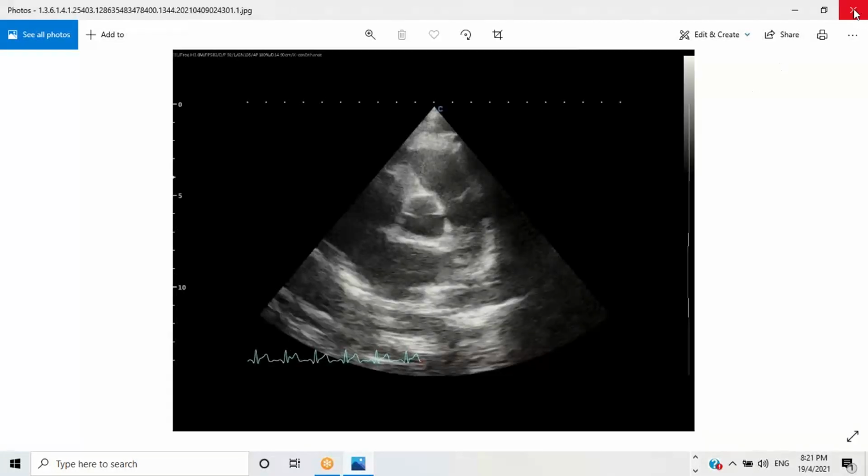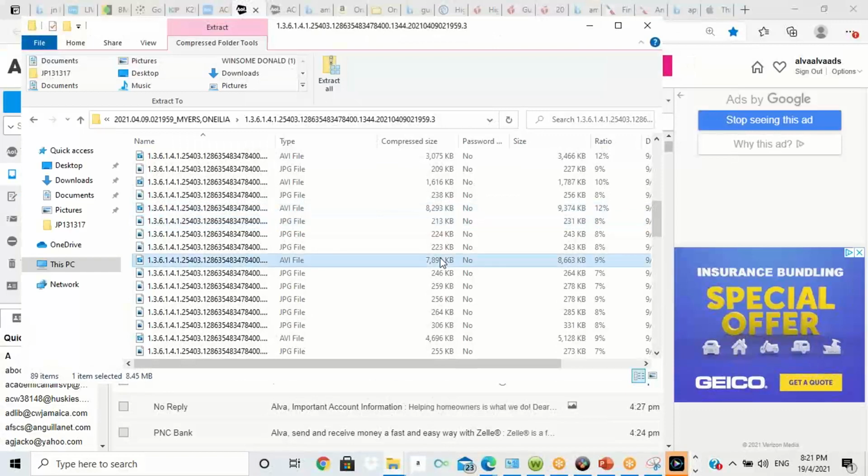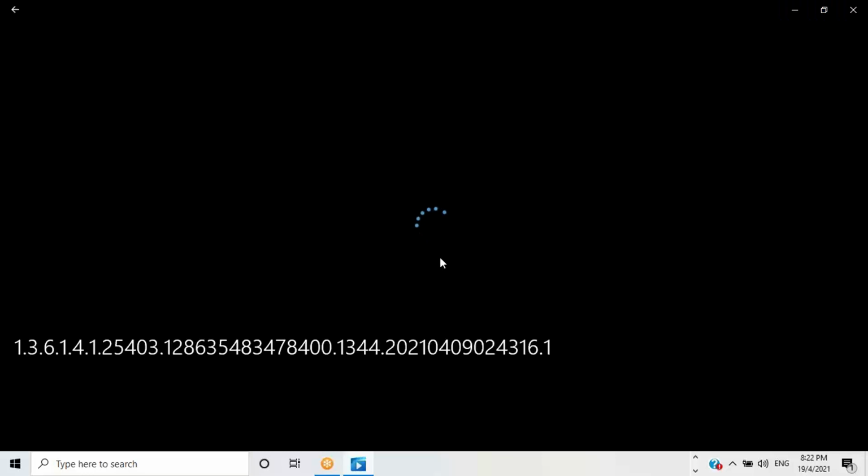One of the things that you need to do is to establish that there are 3 cusps across the aortic valve, or 3 leaflets. It's very important because if the patient has a bicuspid aortic valve, then they're going to run into problems sooner or later.